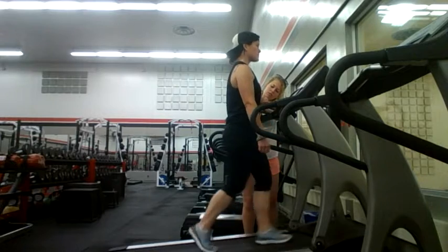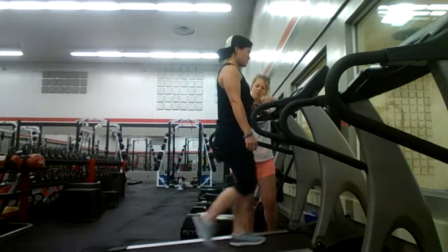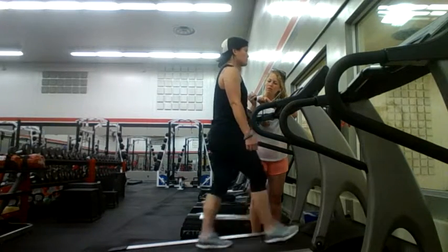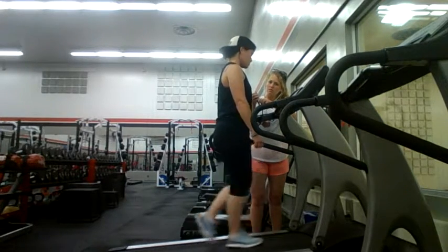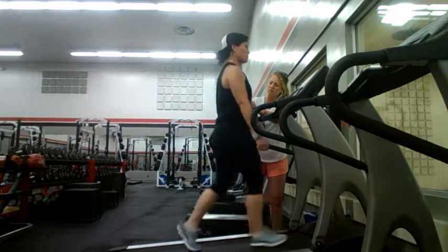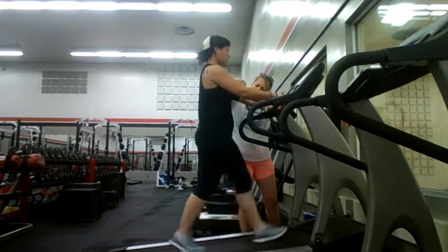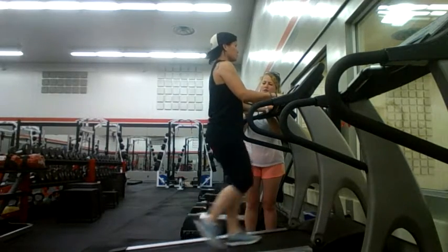The subject has now reached steady state. At this time, we are going to take blood pressure measurements as well as an RPE measurement. As soon as we have taken these measurements, we will increase the workload. The new workload level will be represented as stage 2. The subject has now reached steady state for stage 2. We will once again take blood pressure and RPE measurements. We will then increase the workload of the treadmill.